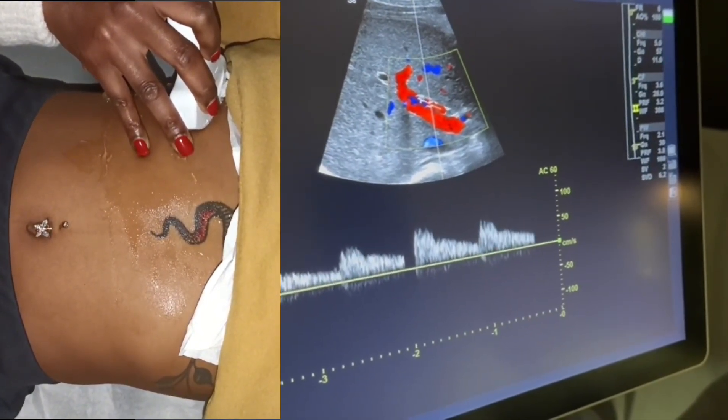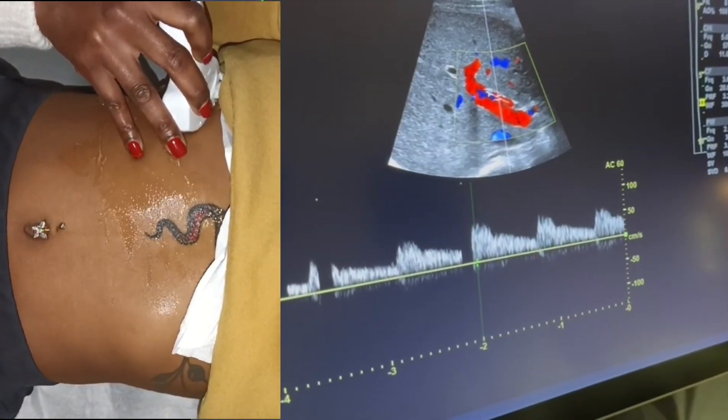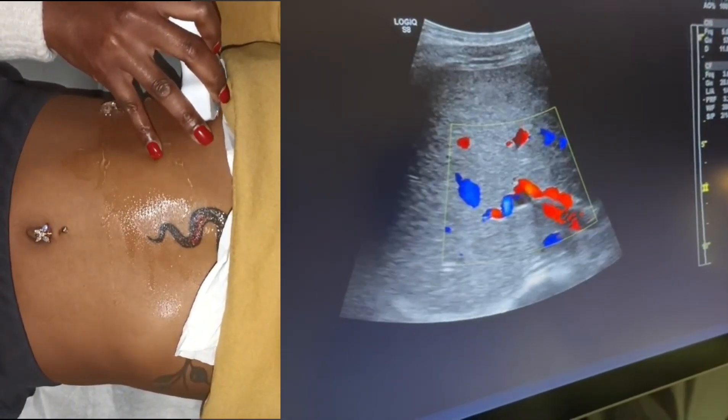You can see a low resistant flow pattern, which is great because the hepatic artery is feeding a major organ. I'm going to come out of that and go right into her portal vein.